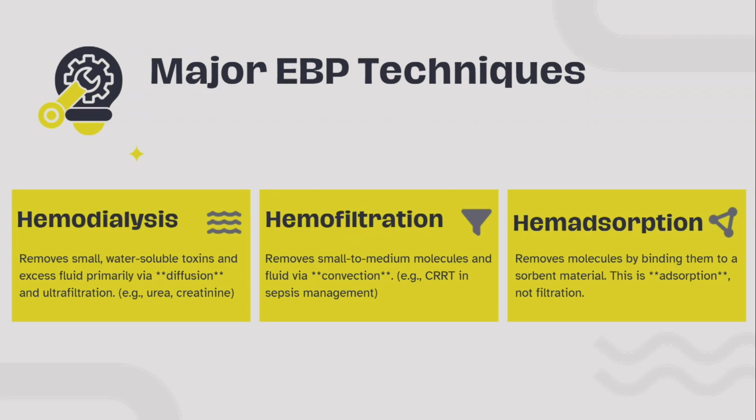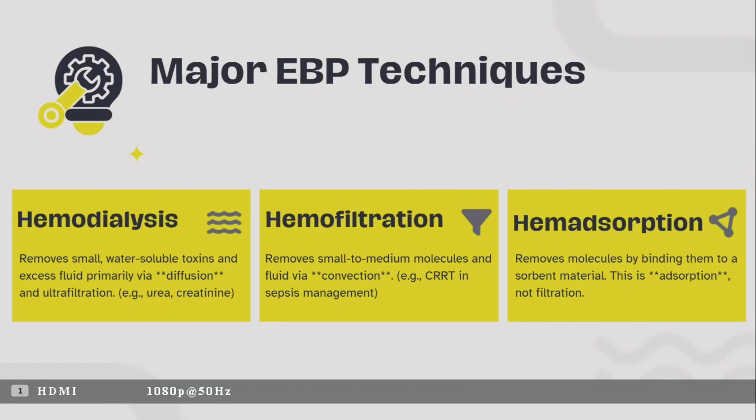Second invention was hemofiltration. Here we put a very high volume of water into the patient's bloodstream, and we take it out through ultrafiltration. That happens by solvent drag, that is convection. The third thing which has come into vogue in the last 15 to 20 years is hemoadsorption. At the outset, I must say that hemoadsorption, hemadsorption and hemoperfusion are synonymous terms. They are used interchangeably in the literature, in the studies and in the textbooks. I am not going to talk about hemodialysis, I will be restricting myself to hemadsorption.